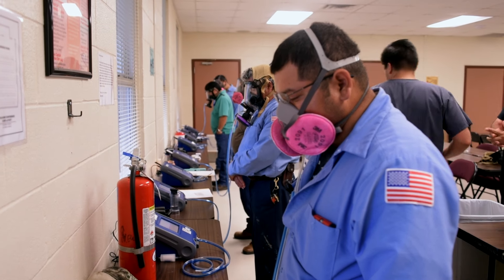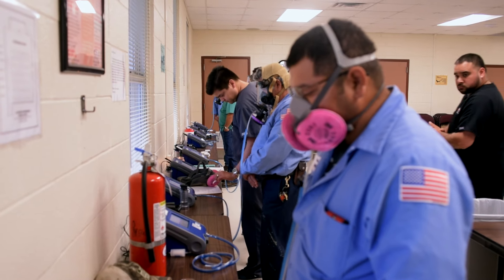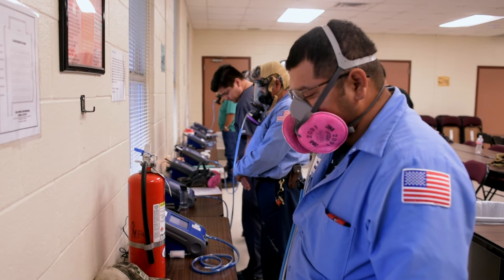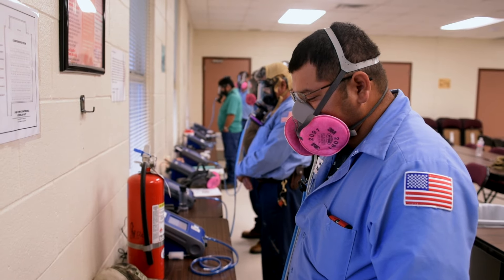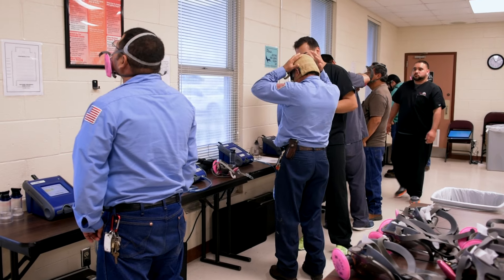It is necessary to ensure a respirator properly fits a worker. Without a proper fit, toxins can leak into a respirator facepiece, which would expose the worker to potentially hazardous substances. So this testing is very important.